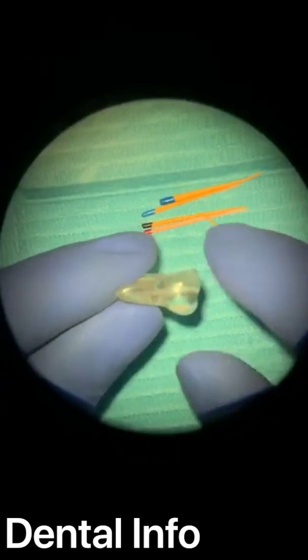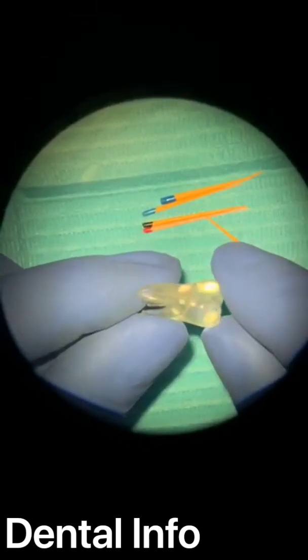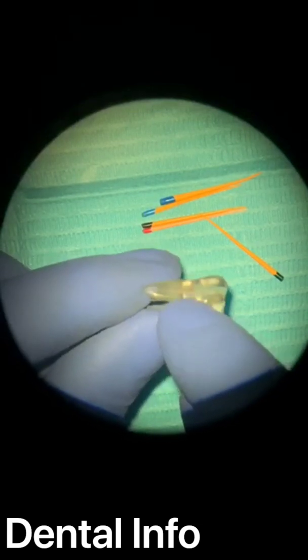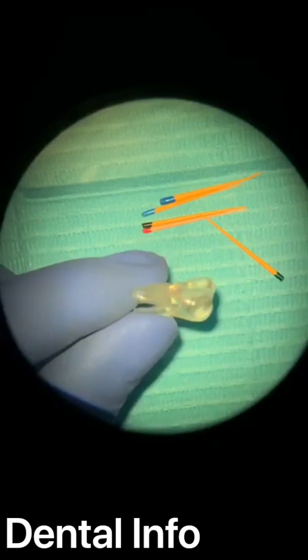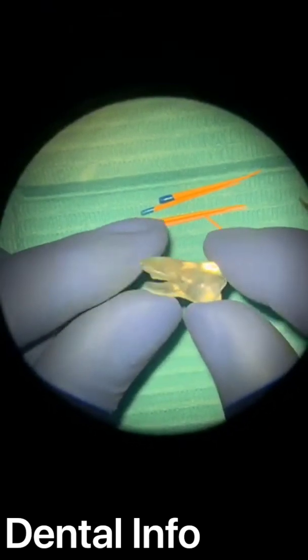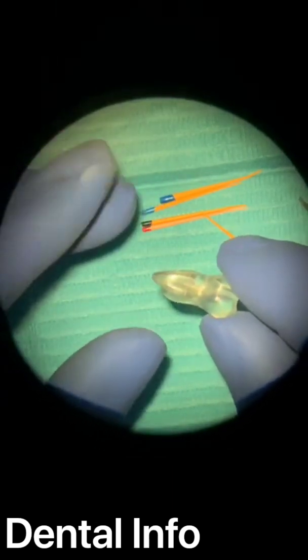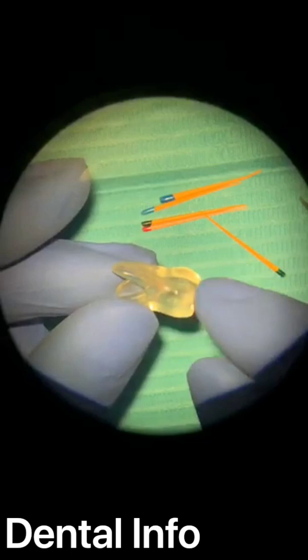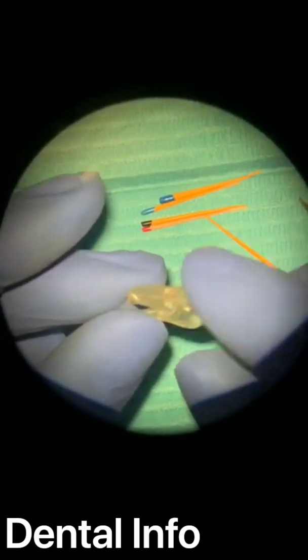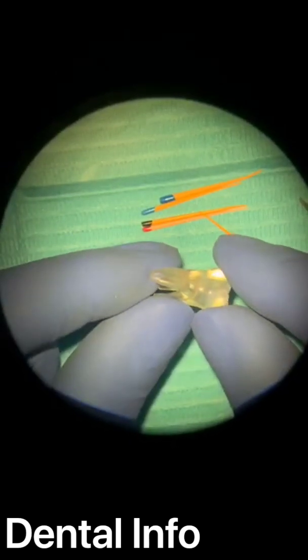After we finish preparation, I want to ask you a question. Are you making the cone fit X-ray with wet canal or with dry canal? I will answer the question. A lot of people making the cone fit with dry canal. So after irrigation, after everything, after preparation, he's drying the canals and he's putting the cone and taking X-ray. That will be not good and not right.